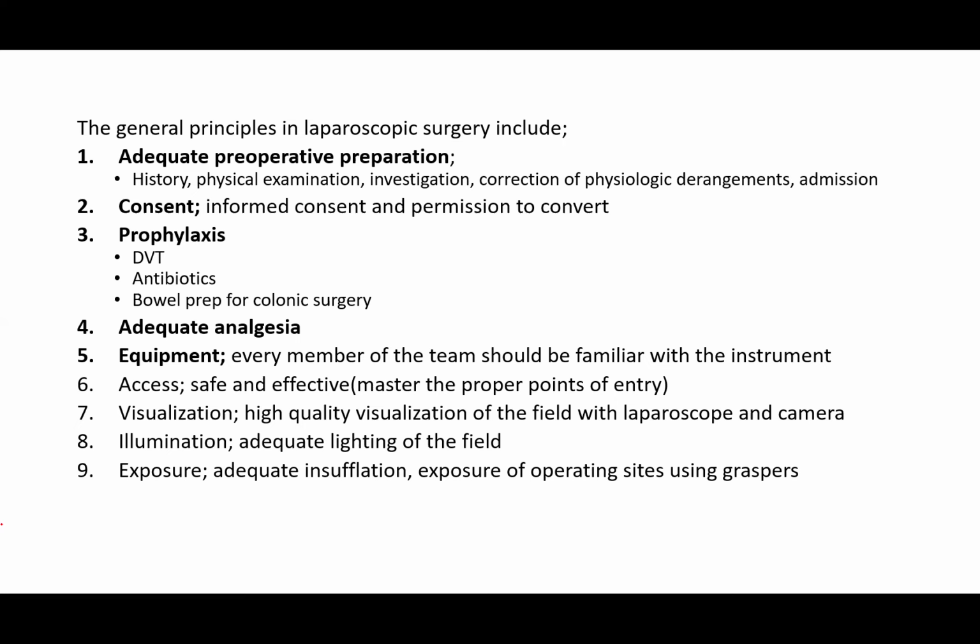Your access must be safe and effective. You have to master the proper point of entry. You cannot just go and start inserting ports anyhow. There is a principle that guides your port placement, which you must be very conversant with. Then visualization: you should have a high quality visualization of the field with laparoscope and camera.